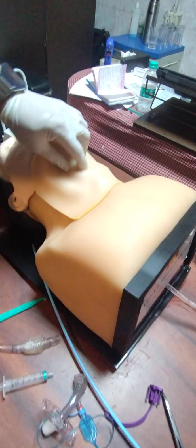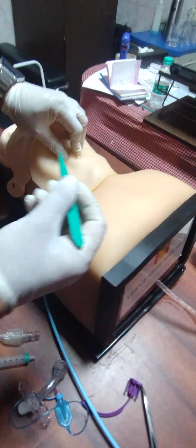You have taken 3 attempts and it's a failed intubation. So you must have all the time, whenever you are intubating, this surgical cricothyrotomy set. So now I suppose this is the second scenario that we have failed in our attempt in intubating this patient. So I am going for a surgical cric. So immediately this is a 3-finger technique. Come to this side now. 3-finger technique. Feel the space. Give an incision.